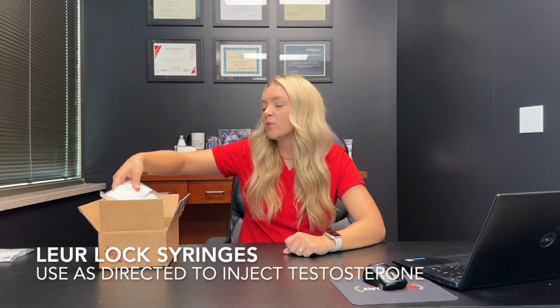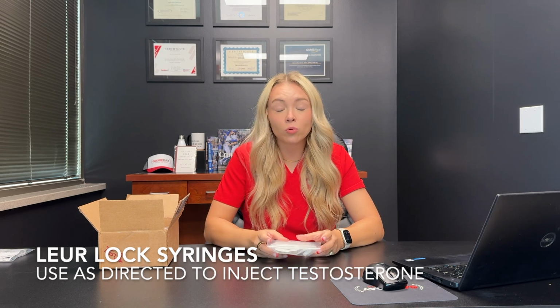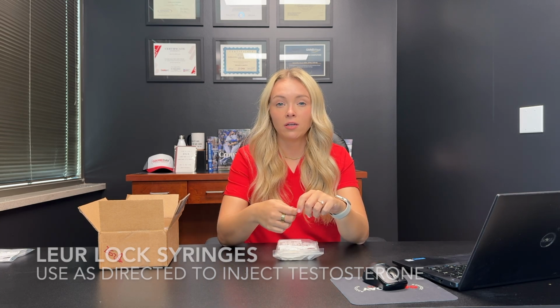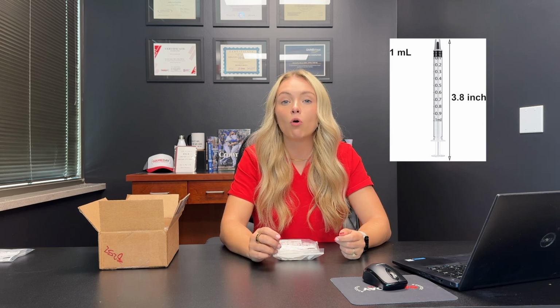Next in your box, you're going to find Luer lock syringes. Syringes are used to draw up the medication as well as inject the medication. Luer lock just means that you're connecting the needle to the syringe in a twisting motion. There are various different sizes of syringes, and yours is going to be dependent on the dose that you're supposed to give yourself per injection. So if your injection dose is 100 milligrams or less, or 0.5 mils, you're probably going to receive a 1 mil syringe. If it's anything more, you're probably going to receive a 3 mil syringe.